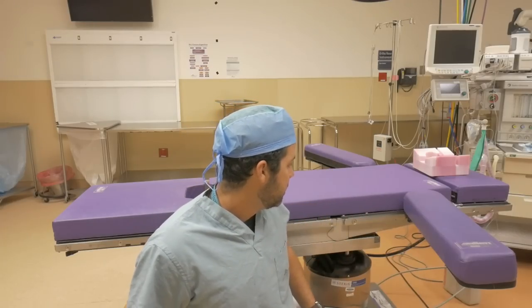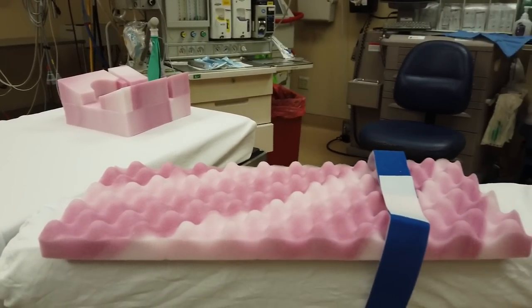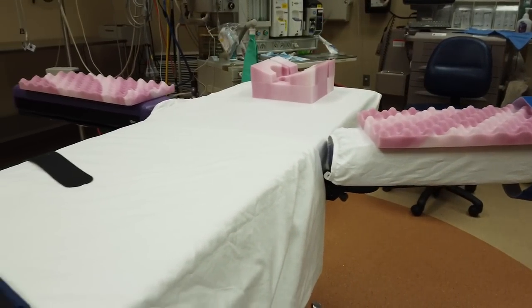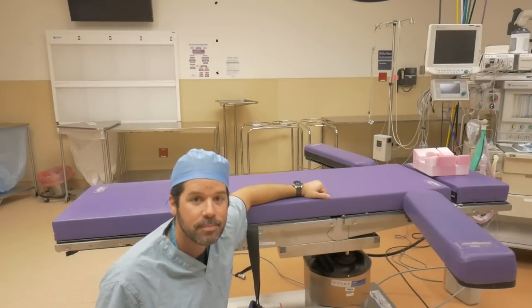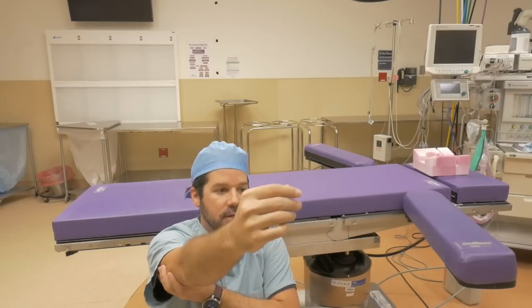You should keep the arms below a 90-degree angle in supine if they are out — typically when working on the lower half of the body. If you're working in the upper half, the abdomen or chest, the majority of the time we will tuck the arms. We have a sheet under the patient and we can tuck the arms next to them. We pad them — pad the ulnar nerve over the elbow and pad the whole arm as we tuck it to their sides.